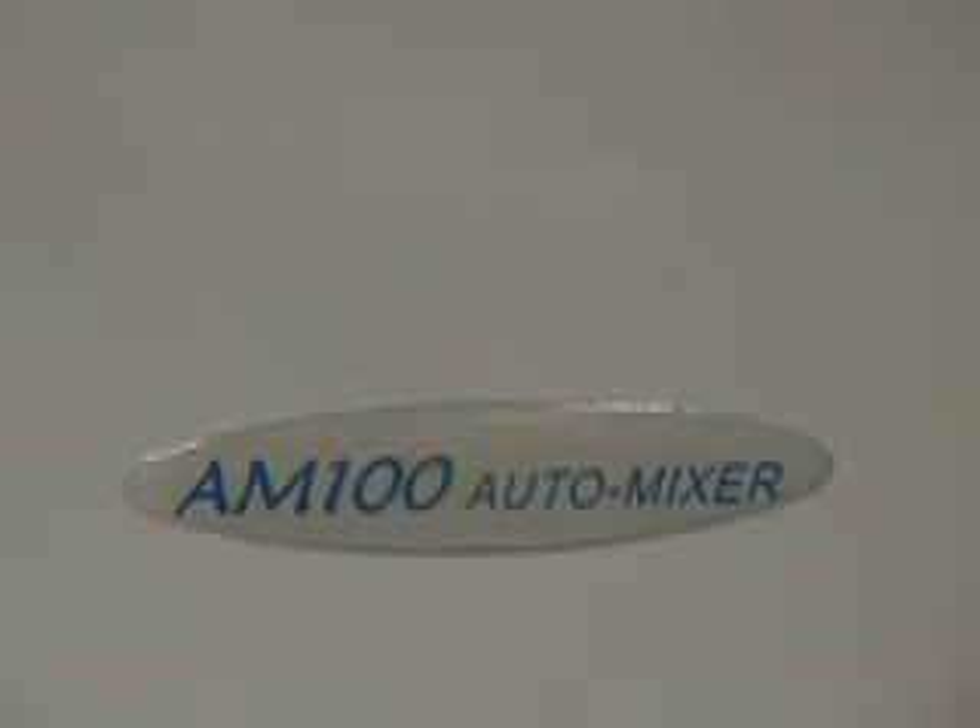The AM100 is available from IDS Dental and ready to ship today. IDS Dental — your dental supply answer.